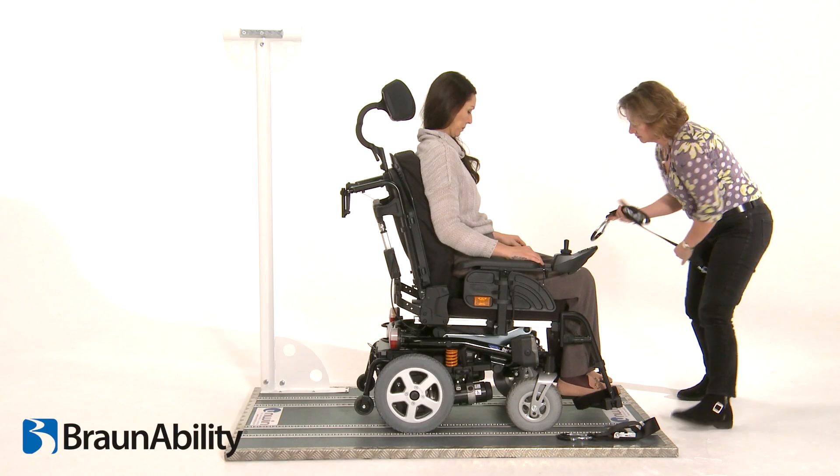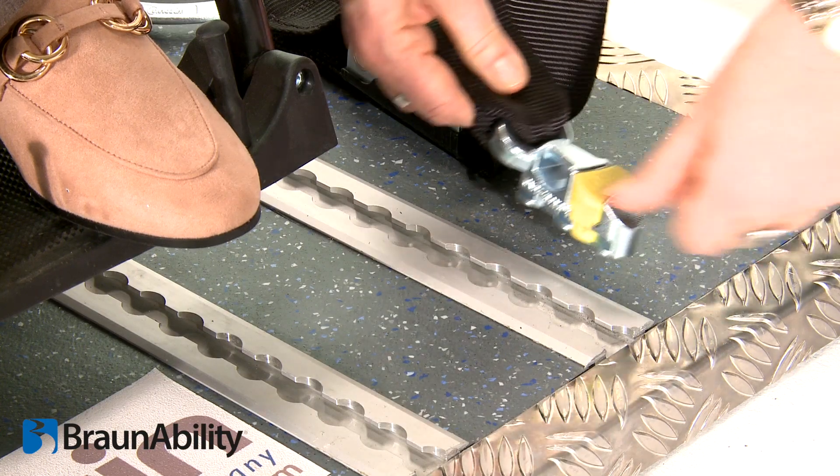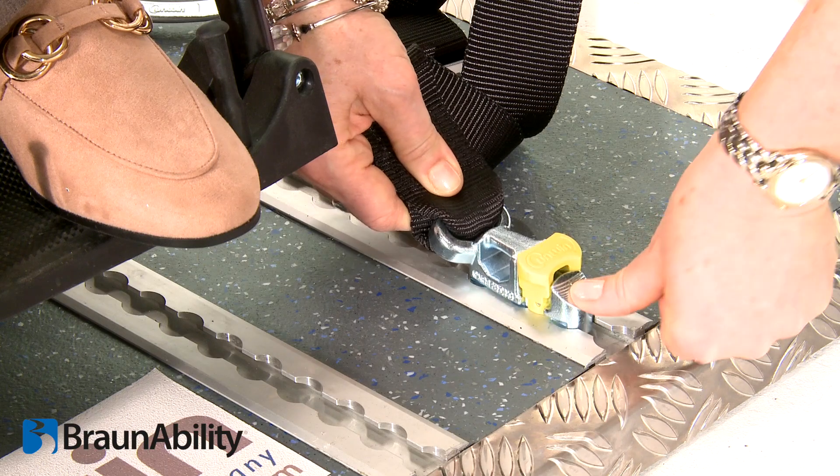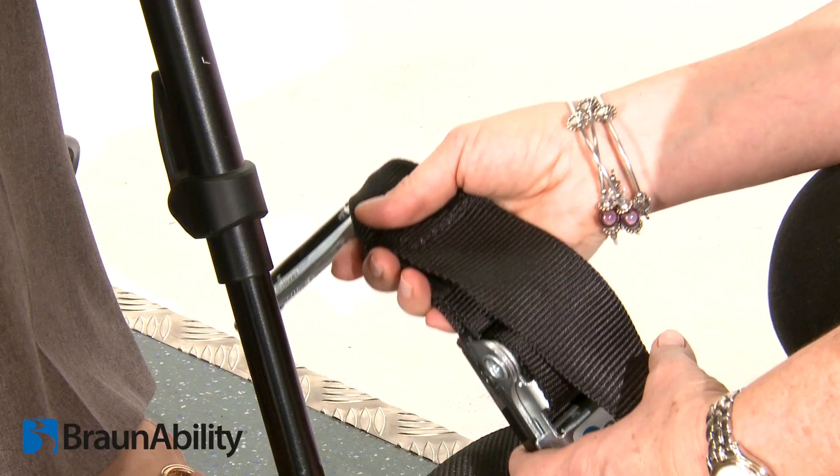To fit the Titan front strap into the rail, press down on the ribbed part of the aluminium track fitting, or ATF, and push firmly towards the wheelchair until the yellow clip drops and locks into place.